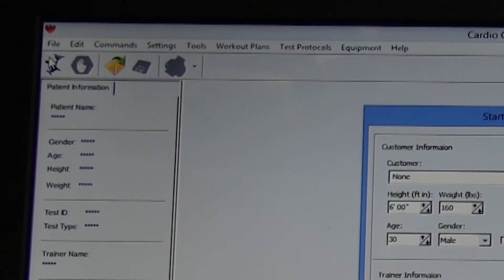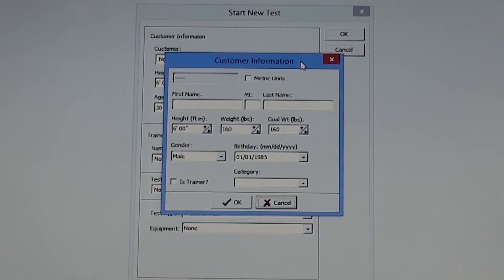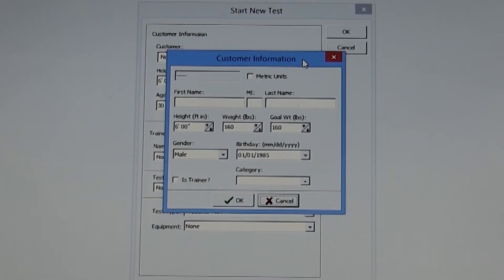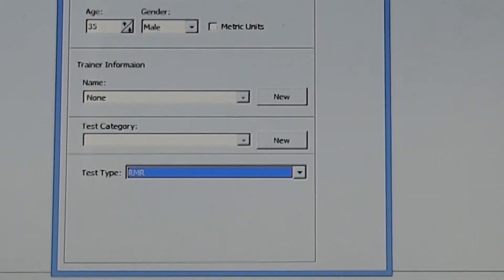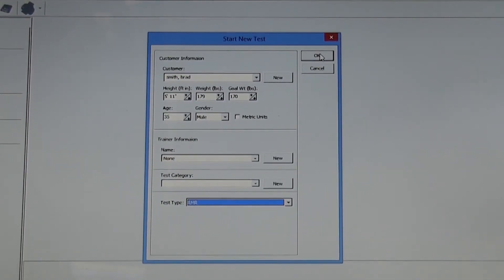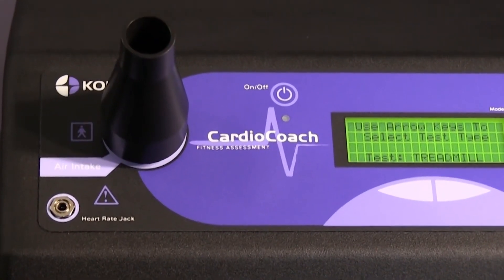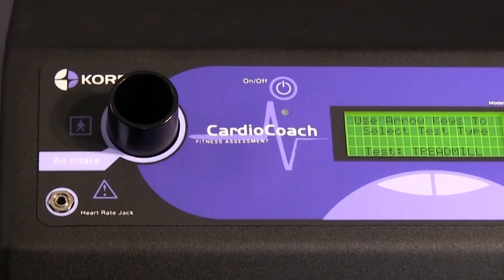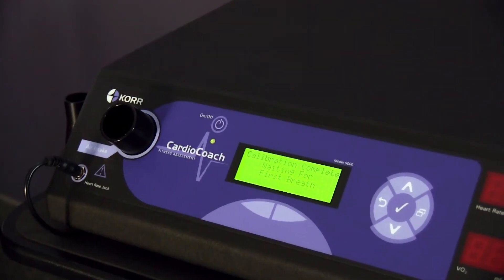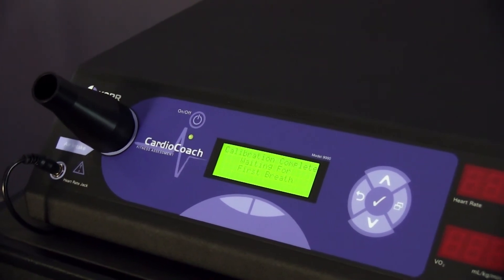To begin a test, click on the bike icon in the upper left-hand corner and enter all the requested information including your client's age, height, weight, and gender. Select RMR as your test type, click OK, and the machine will begin to calibrate. During the calibration process, be sure that nothing is blocking the air intake valve, including the black funnel. When the calibration is finished, place the black funnel on the air intake valve.